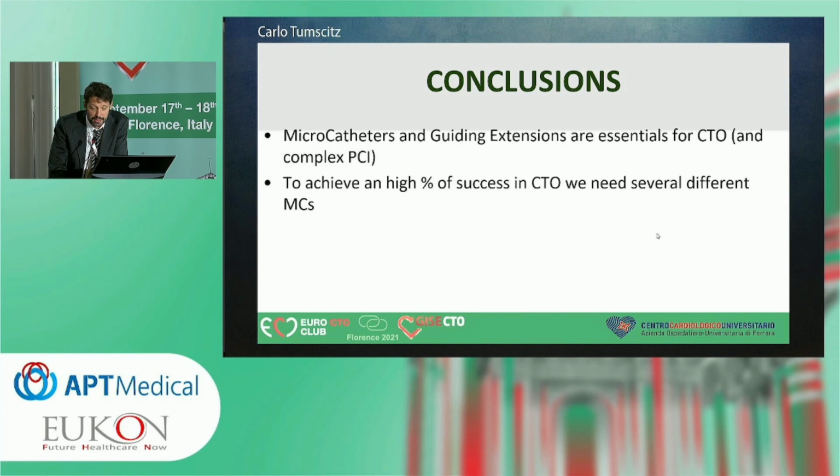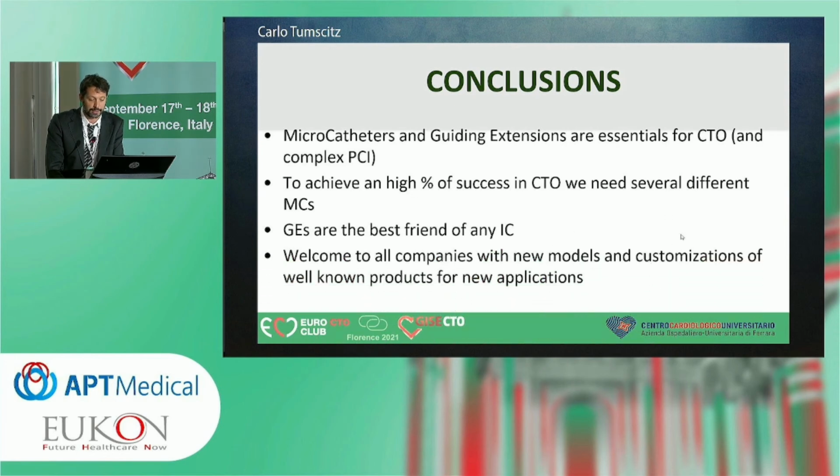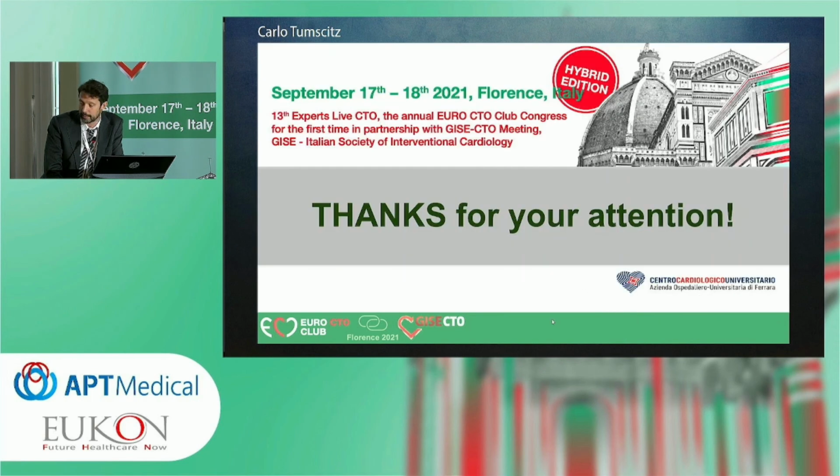Okay, I'm just saying that the guiding extensions are essential. We probably need several and different microcatheters, and the guiding extension is the best friend of any interventional cardiologist, in my view, and we welcome all companies that create new models and customization of well-known products. Thank you very much.